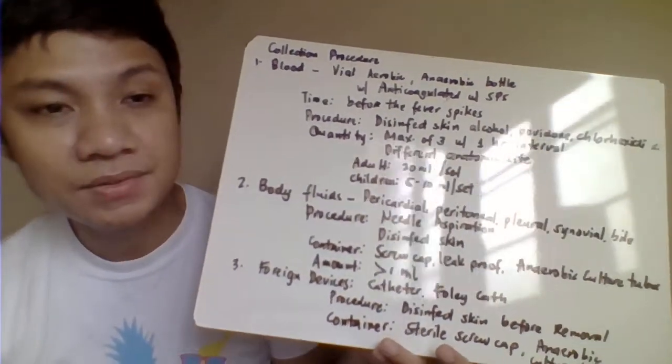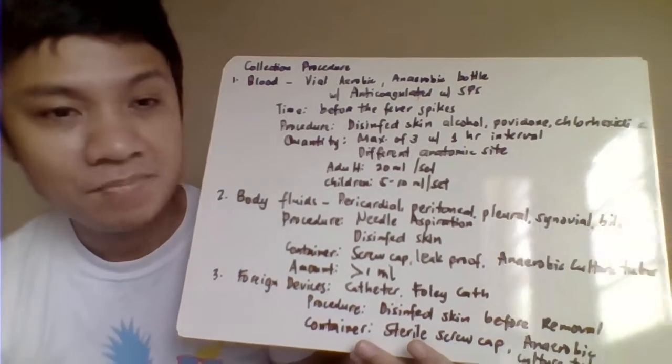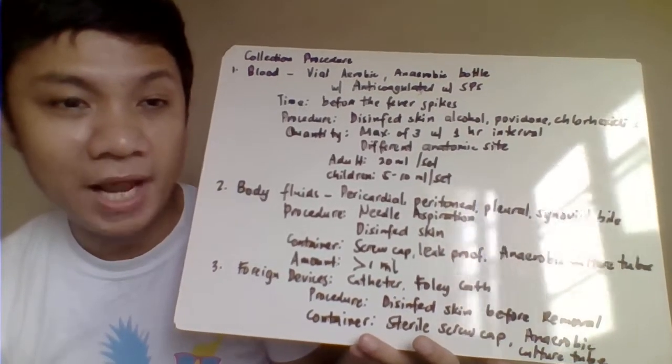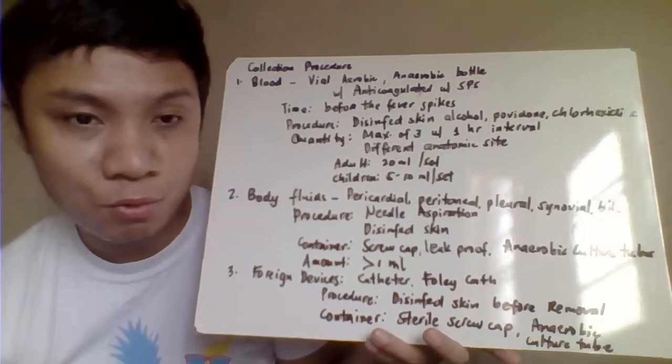Okay, we have this one. So, the quantity: a maximum of 3 specimens. It's a bit traumatic, I mean invasive, because we'll be collecting not only 1, but 3. Maximum of 3, but you can have 2.